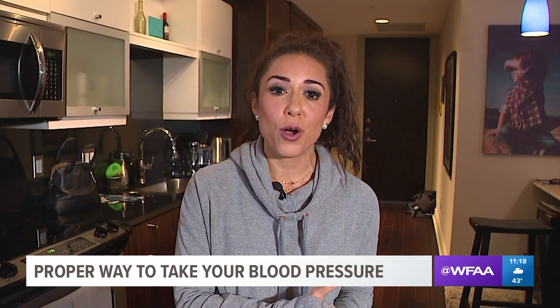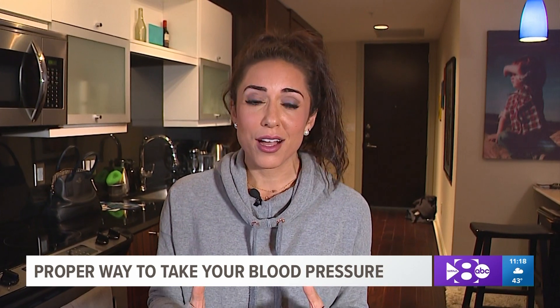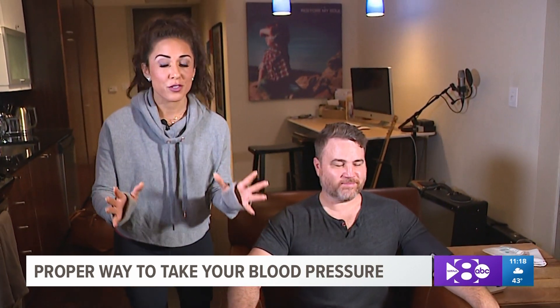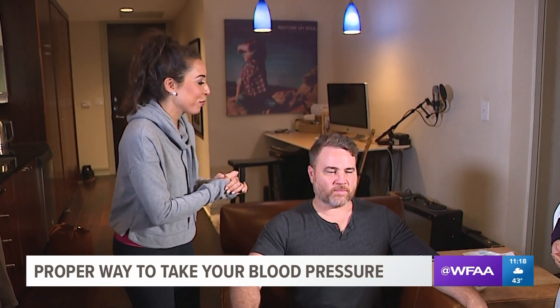It is Heart Month and it is Wellness Wednesday, and today we are talking about the proper way to take a blood pressure measurement, whether you're at home or whether you're at your doctor's office. Unfortunately, there are a lot of doctors who don't get this right.